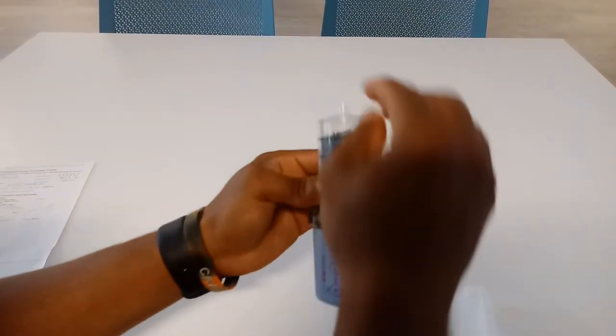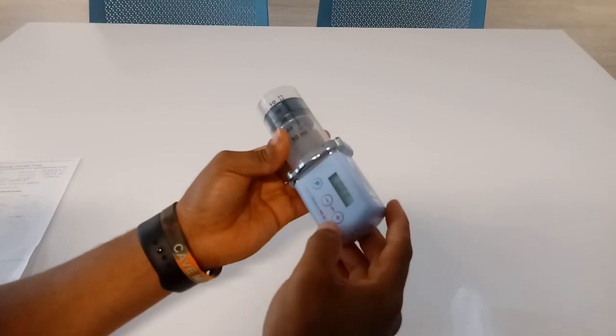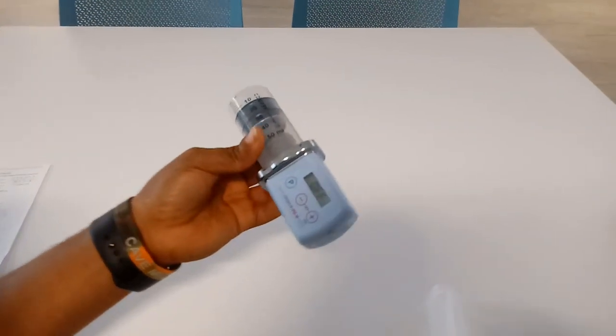And when the patient attaches the infusion set to their body, to the pump, and turns it on, the pump starts to work.